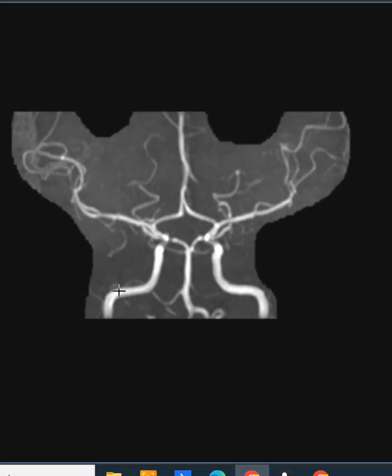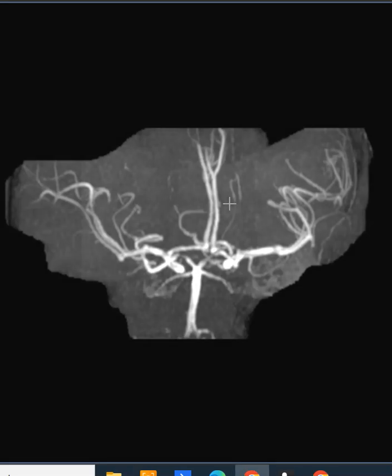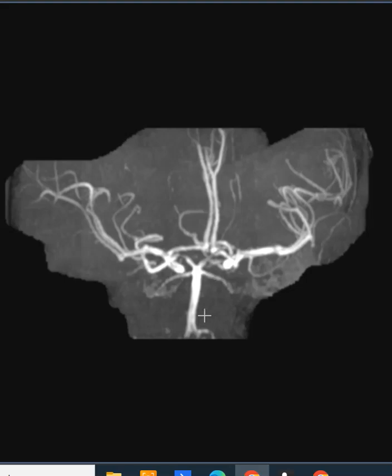This is back to the normal patient where we see the right carotid coming up and left carotid coming up — these are the main feeders to the brain, along with the basilar artery. And now looking at our patient from today, they just have this one basilar artery coming up, feeding everything. So a very rare case of bilateral carotid occlusion, the brain being fed by a single basilar artery. Thank you very much.